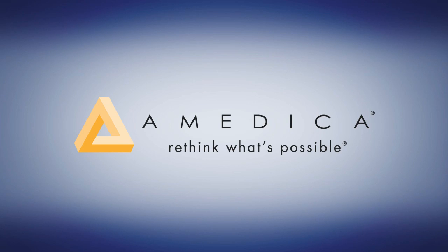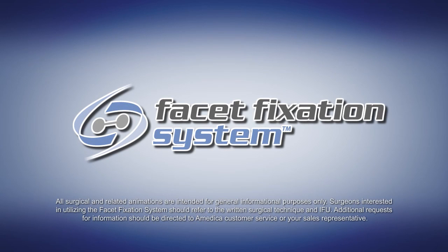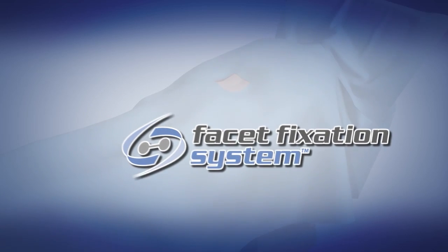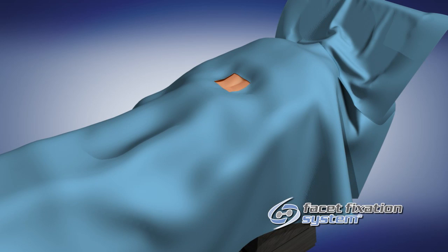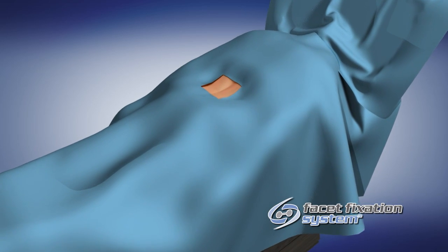The Amedica Facet Fixation System can be used to stabilize a spinal motion segment that is at risk for becoming unstable from laminectomy. This surgical technique describes using the Facet Fixation System via an open technique at the L4-L5 Facet Joint.